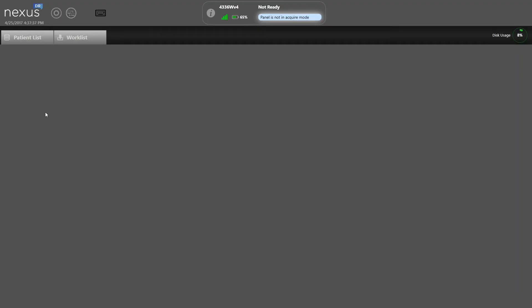This is a brief overview of the Nexus DR software that powers the Varex wireless DR detectors. We've launched the icon and we're inside the software. This is the screen you'd be presented with when you first begin. As you can see, it says the panel's not ready. That's because we're in demonstration mode, but in a live situation the panel would be ready and these indicators would all tell you that you'd be ready to start working.